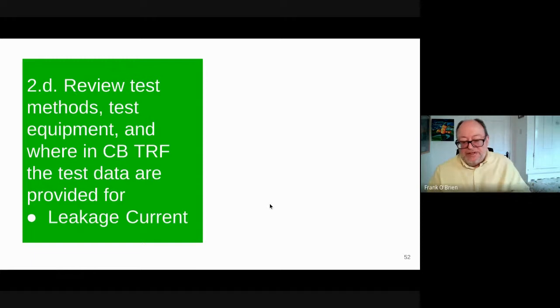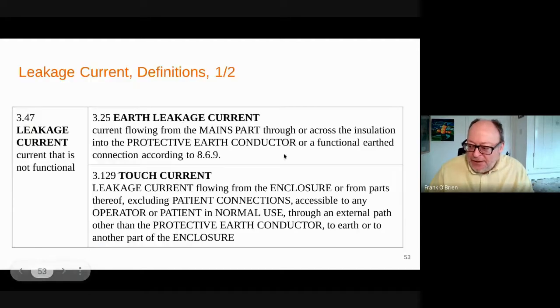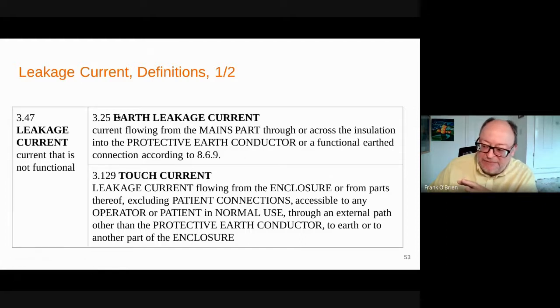All right, so they come out and they get a dielectric and leakage. We generally do the leakage first and then the dielectric. Leakage is a bit complicated, and time-wise I'd like to be finished, so I'm going to risk going too fast. Here's your standard, organized, format-wise by me, but the text is correct.